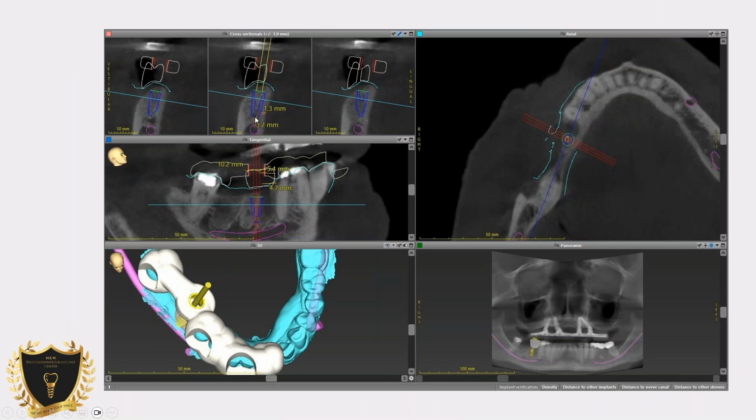You need to make sure you keep it safe and stay in the safe zone. Drawing a nerve is very important. If you're in the sinuses, you can do that. This patient had an all-on-X done on the top, looking for a number 30 implant.